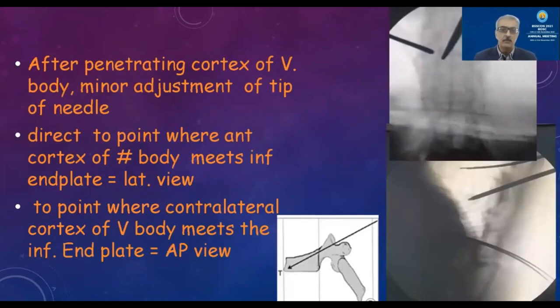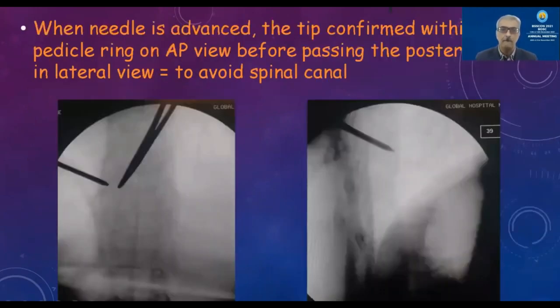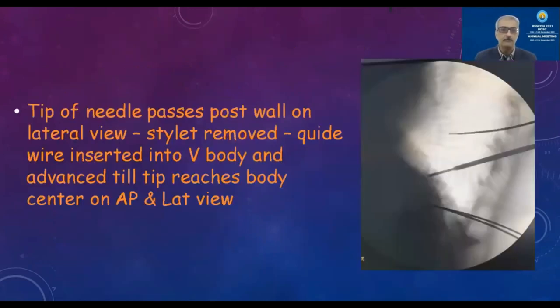After penetrating the cortex of the vertebral body, make minor adjustments so that in the AP view the tip points to the lower and inferior border of the affected vertebra, and in the lateral view points to the anterior inferior aspect. Before advancing the needle, confirm that the tip in the AP view is within the ring of the pedicle before it passes through the posterior cortex — this ensures you do not damage the spinal canal.